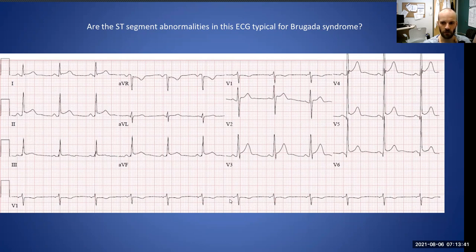Early repolarization was a good suggestion because you tend to see that exclusively in the lateral leads, sometimes in inferior as well. In fact, this is a patient with pericarditis with global ST segment changes in this saddle morphology. But well done for spotting that it's not typical. That was the main thing. Very good.